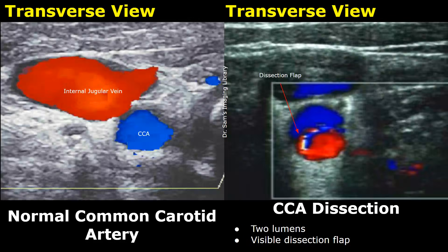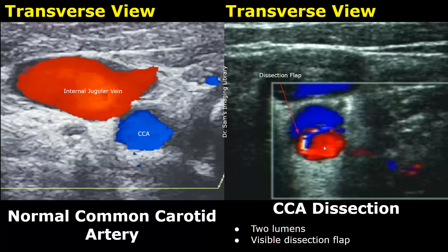This is a transverse view showing the common carotid artery and jugular vein. Over here we have CCA dissection in transverse view with color Doppler applied. We can see the two lumens with a dissection flap in the middle. We may also find some color mixing on color Doppler.